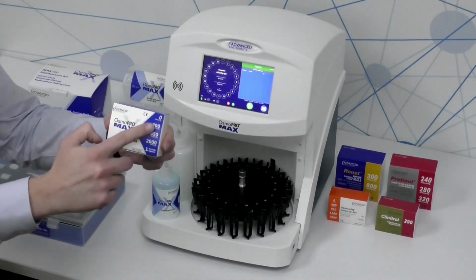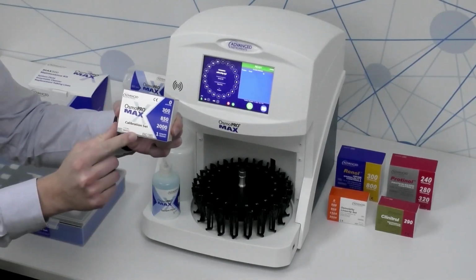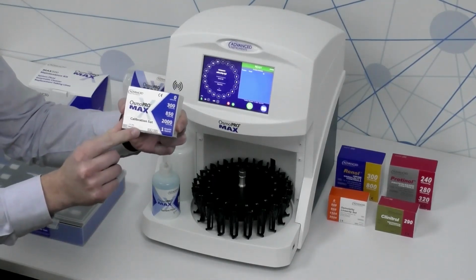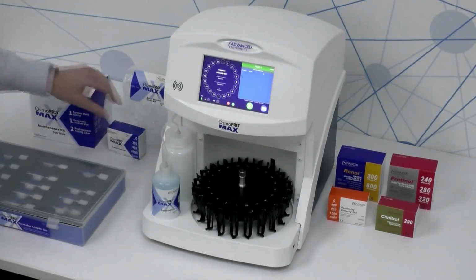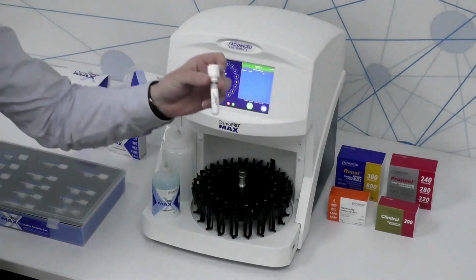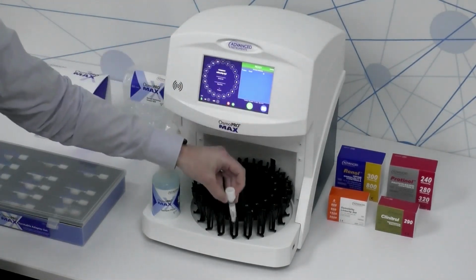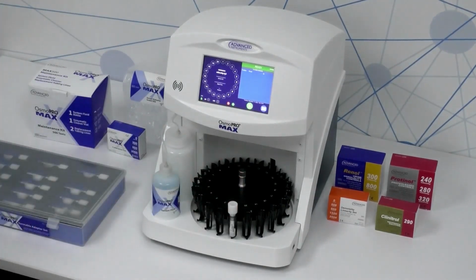So we have the 0, 300, 850, and 2000 milliosmol levels, as well as an ampule opener. In order to run the calibration, the ampule adapters for each one of those levels would just need to be placed onto the turntable, and then the calibration process can be completely automated.